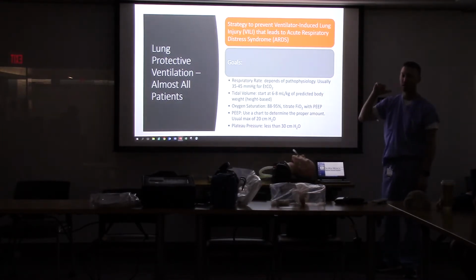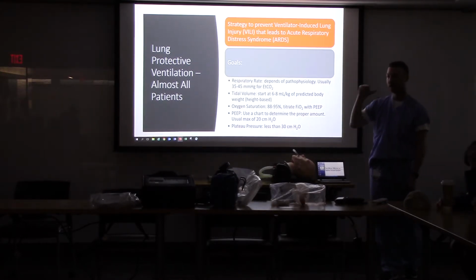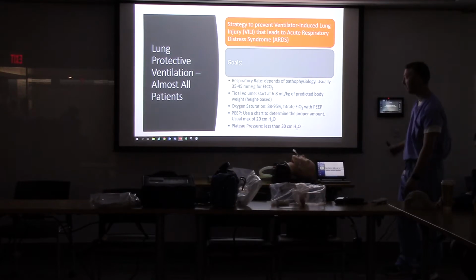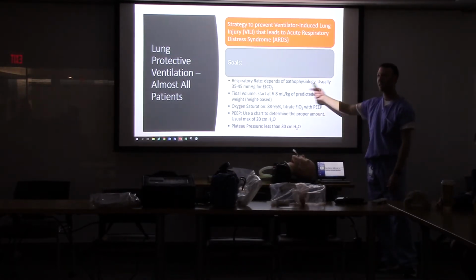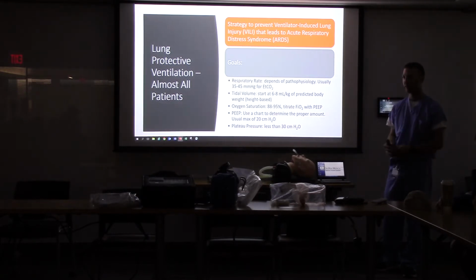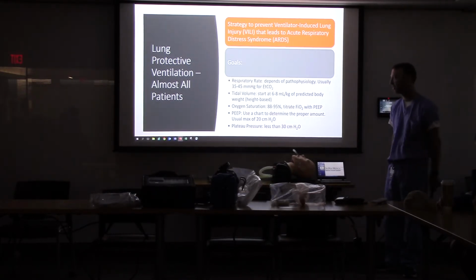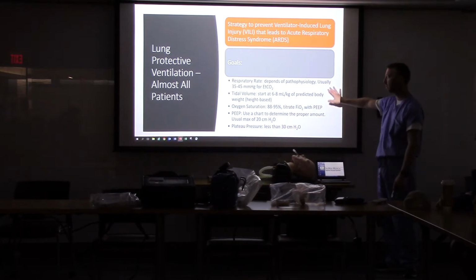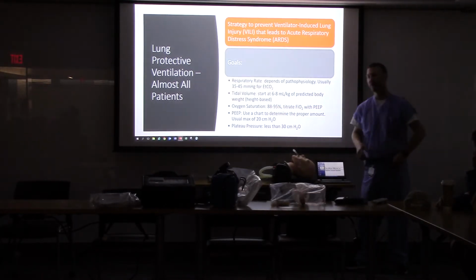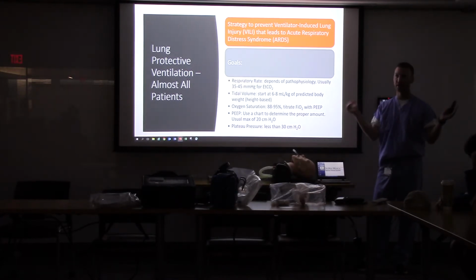Well, my coworkers at Barnes, a bunch of the EM ICU doctors there, came up with a big trial that found that if we do this in the ED, we save lives. And it's actually really easy. It's very protocol driven. The respiratory therapists are on board with this, and they work within these numbers. And it's all height based. Your lungs, if I add 300 pounds to all of you right now, your lungs don't change in size.